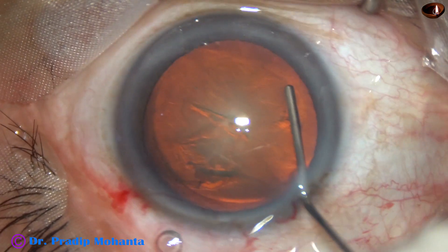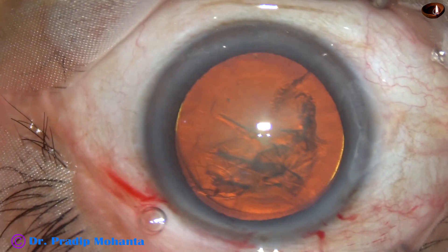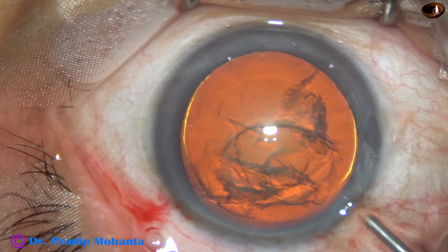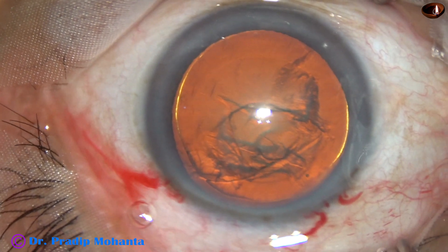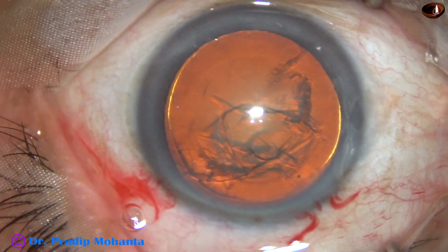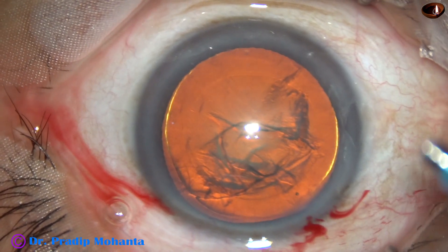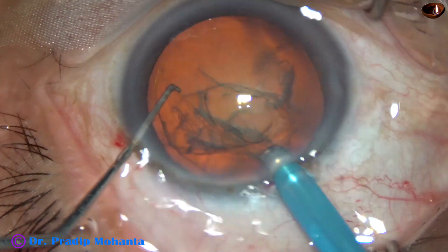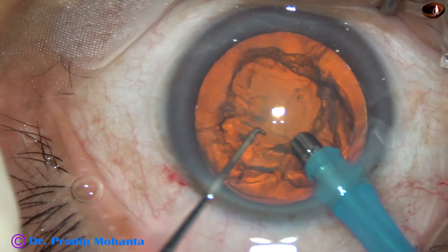Hydrodissection and hydrodelineation is done. Viscoelastic is again injected into the anterior chamber. And now is the time to introduce the tip of the phaco handpiece. The machine being used is Faros with split mode from Oertli, Switzerland. Here it is.